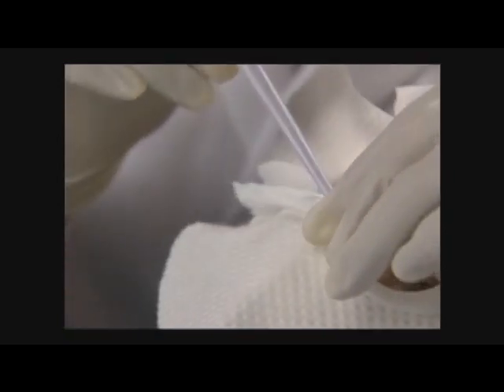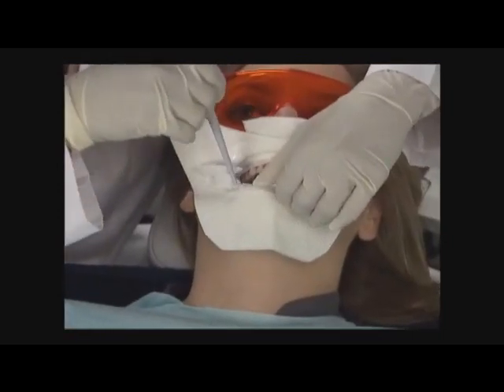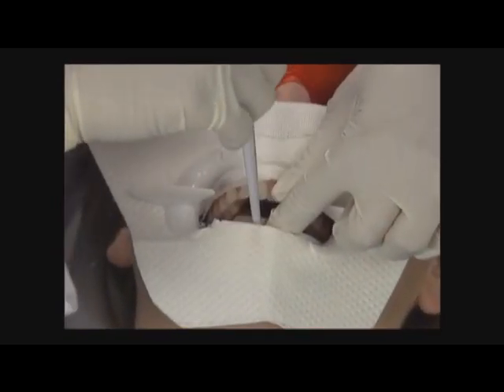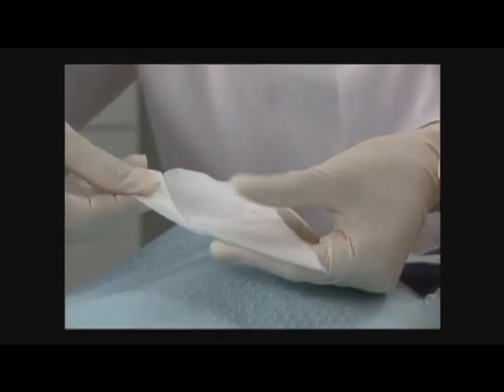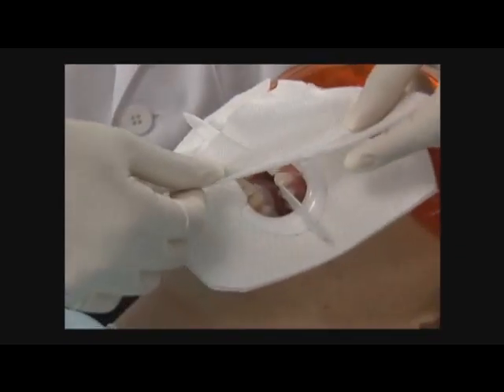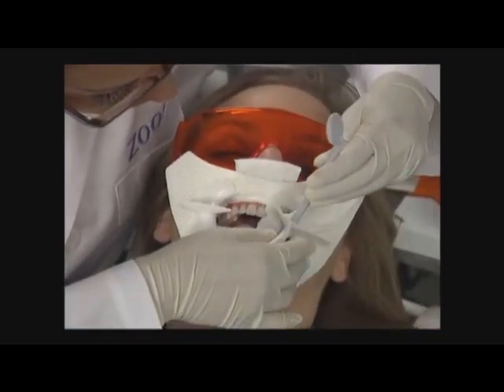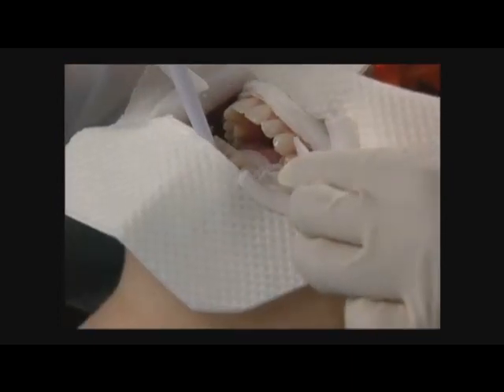Take the fourth piece of 2x2 gauze and repeat this step for the lower vestibule, covering from approximately number 30 to number 19 in the lower arch. The fifth and sixth pieces of gauze will be placed in each cheek. Fully open the gauze and fold it into a triangle. Place the apex of the triangle into the posterior cheek and tuck the end into the flange of the cheek retractor.